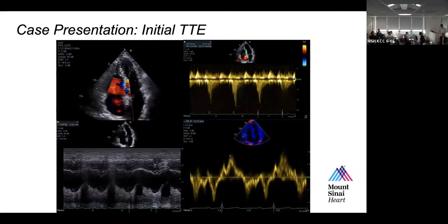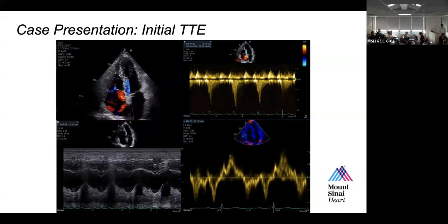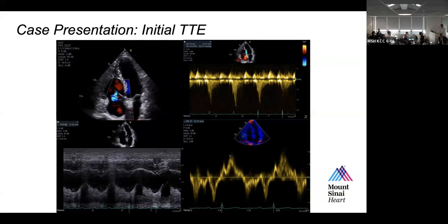All right, great. So we have some more images here. What do you think about these? Over here you have your tricuspid regurgitation shown in the first image with the color Doppler. There is about mild to moderate tricuspid regurgitation. The second one is your continuous wave Doppler. I think the velocity is about 2.6. So the RV-RA pressure gradient is about 27. Your TAPSE is preserved. So although the RV is dilated, it's not really hypokinetic for now. And similarly, your S prime is 17, again consistent with preserved RV function for now. Terrific.